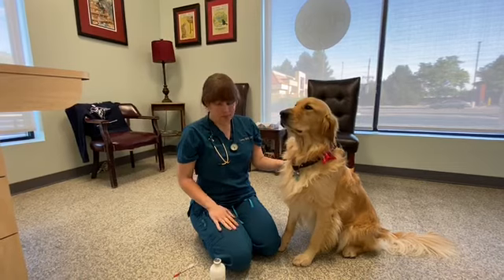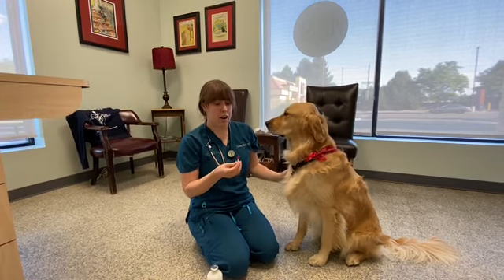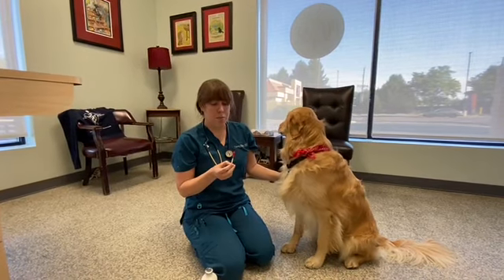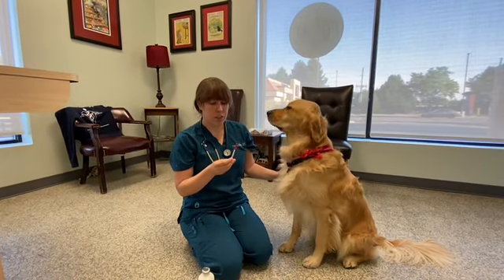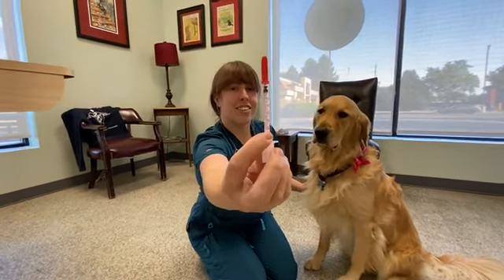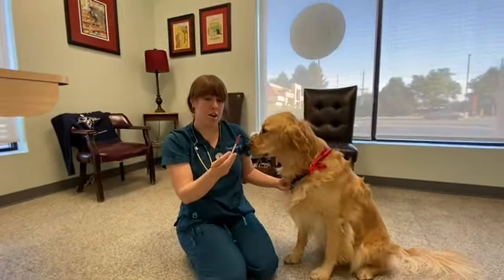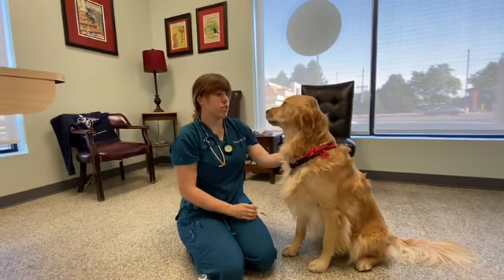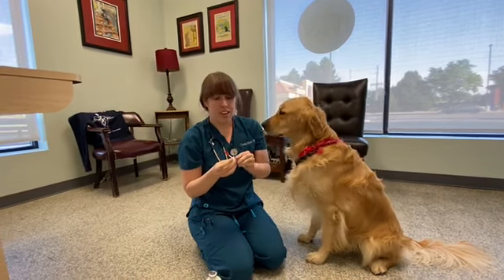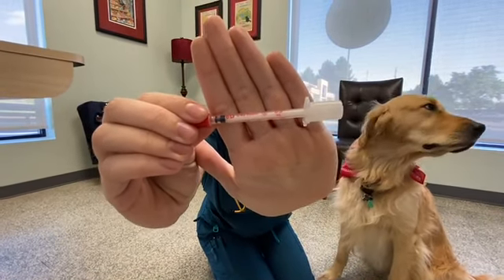Everyone has a little bit different insulin. So you're going to need your insulin syringe. These are very specific syringes that are labeled for insulin. You also want to check on your syringe the part that's labeled for units versus MLs. Each different insulin is labeled for different syringes. So this would be for a U40 insulin — you can see that here on the side — and it'll say what kind of insulin it is on your bottle when you get it.